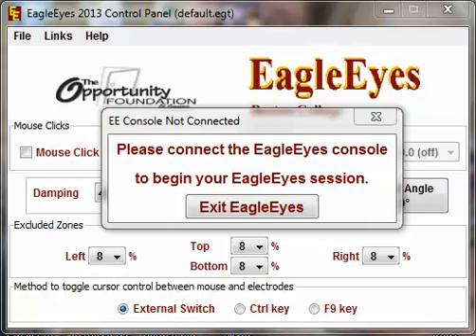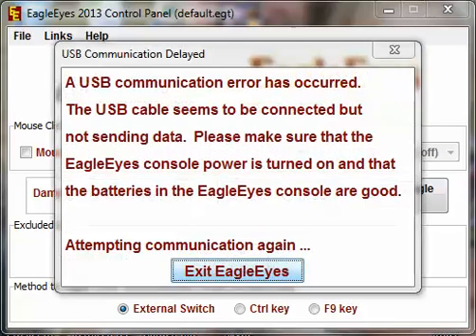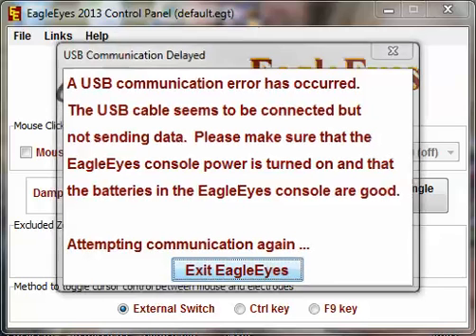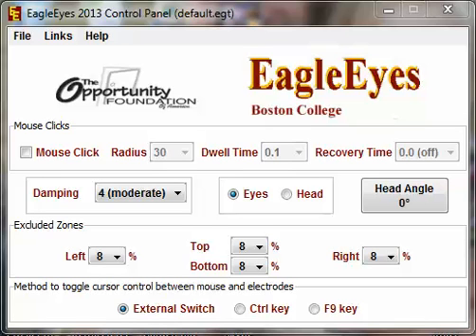Double click on the software and it will open up the window you see on screen. I did this on purpose — it says 'Please connect the EagleEyes console,' because my USB is not connected. So I'm going to plug that in right now. As we plug it in, we see that warning disappear, but we get a second warning: 'A USB communication error has occurred,' because the console is not turned on. So now I'm going to turn on the power, and now everything's up and running.